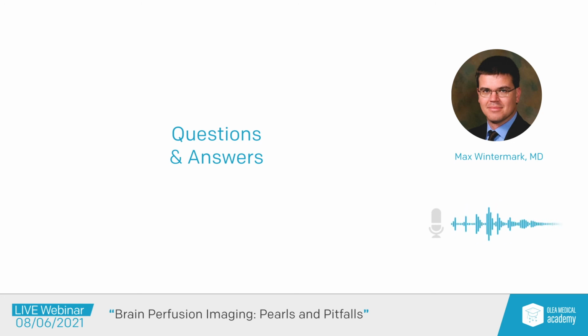And I think what you see is completely correct. When you take the same patient, the patient gets the same perfusion CT, and you take the same perfusion CT data set and feed it to different software, you get slightly different results. Exactly.